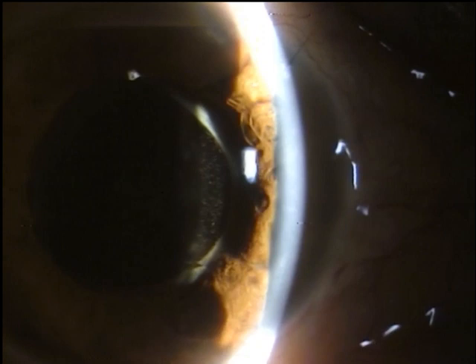I'm showing the slit lamp, and you can see the iris bowing forward. There's a PCIOL in the back, and there seems to be mild posterior capsular thickening in this case. I think there are multiple findings in this case. When you go to the periphery, the width of the angle is less than 1/4 of the cornea. So that's according to Van Herrick.